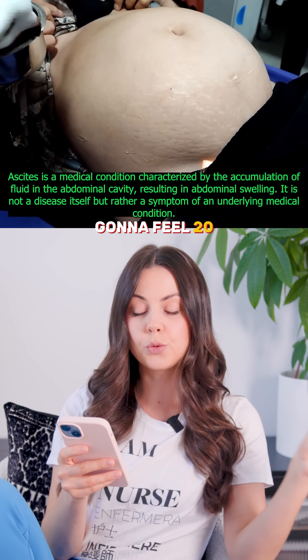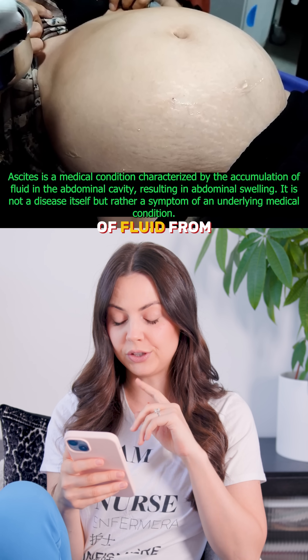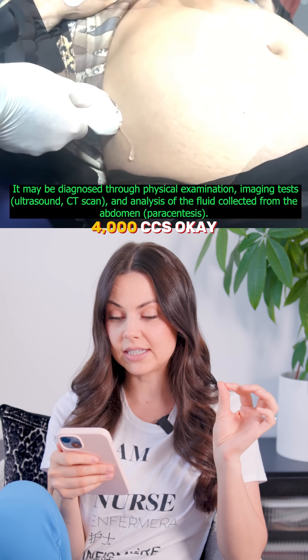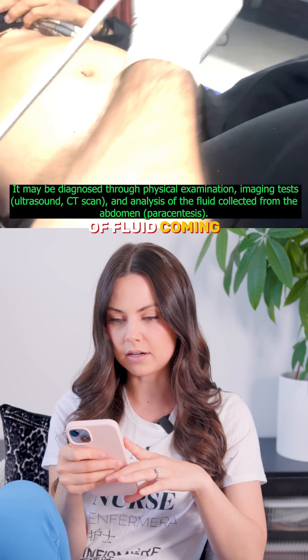This patient is going to feel 20 pounds lighter after this procedure — removing 4,000 cc's of fluid from the abdomen using ultrasound-guided paracentesis. 4,000 cc's — that is four liters. That's a lot of fluid coming out of this abdomen.